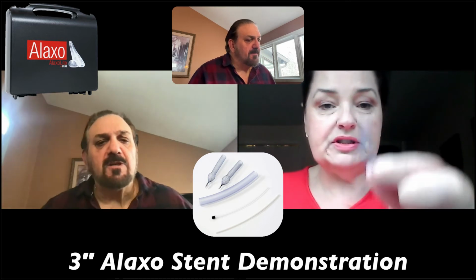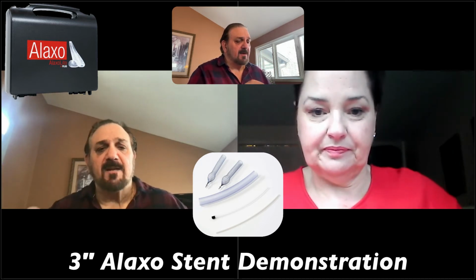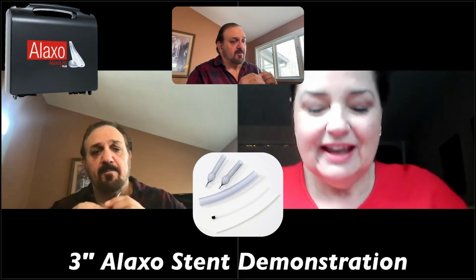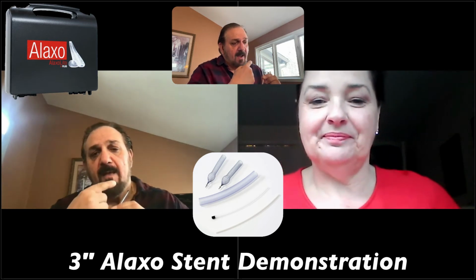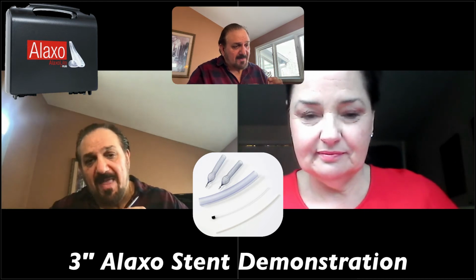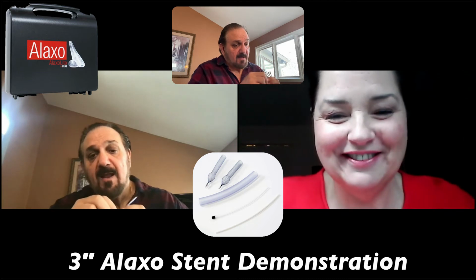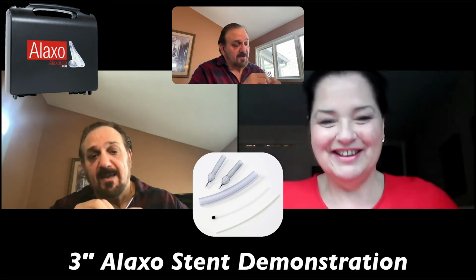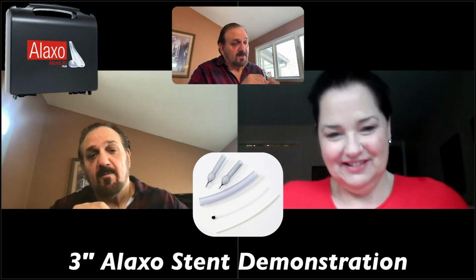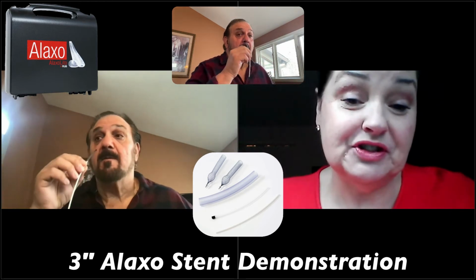Now, what I was supposed to be pulling out at the end there was that plastic clear tube that was on top. The pusher rod was all the way up, and I was pulling on that, so I was pulling it out slowly, rather than pulling the exterior tube. Exactly. And I did the very same thing the first time.